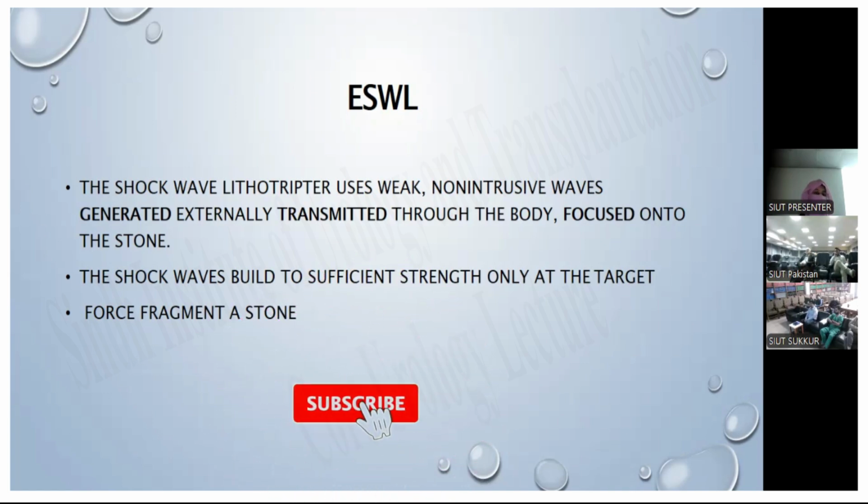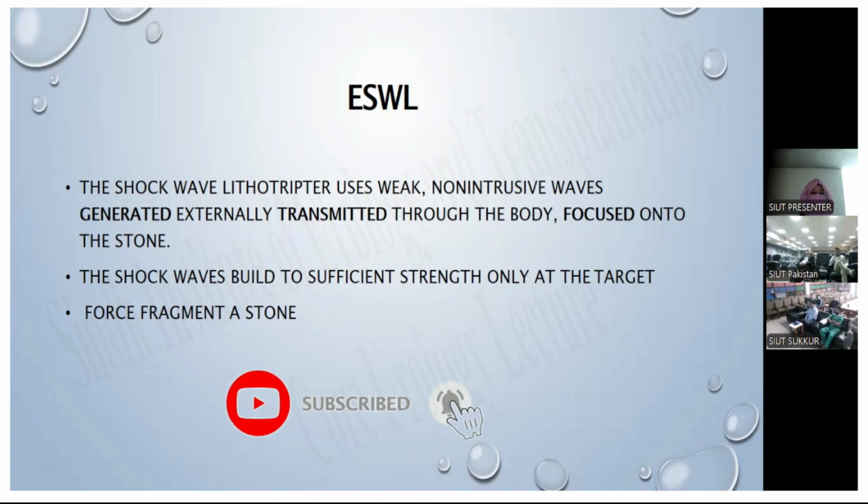Coming to ESWL, which is shockwave lithotripsy, as the name suggests, extracorporeal. In this case, it uses weak, non-intrusive waves generated externally, transmitted through the body, focused on the stone. The shock waves build to sufficient strength only at the target focus for fragmentation of the stone.